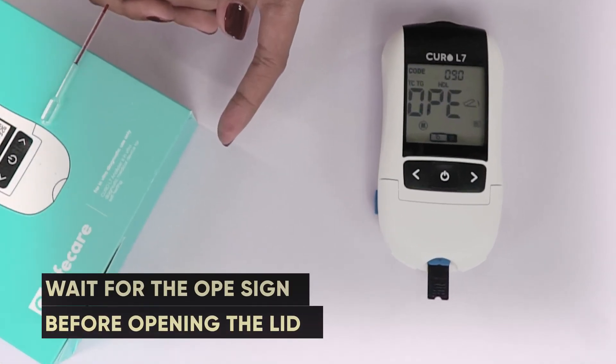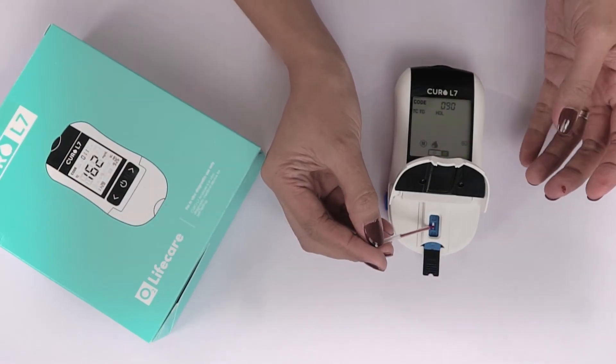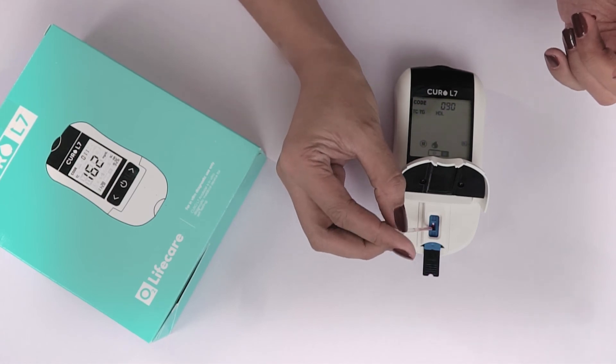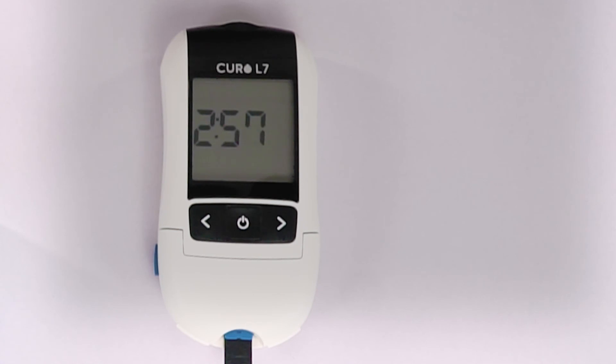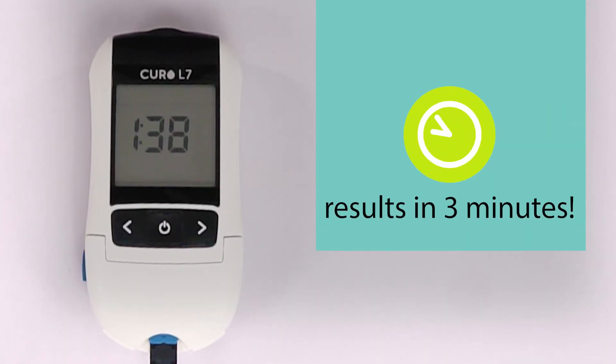When you see OPE on the screen, that's the only time you can open the lid of the Curo L7 device. Gently press the bulb of the easy tube to release the blood sample to the testing slot. It will now show CLO, indicating that you need to close the lid. You will have your result after three minutes and you're done!